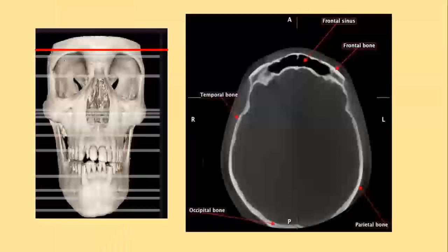Right. I thought I'll spend a few minutes here on gross anatomic landmarks. I mean, this lecture could go on and on, but I'll just briefly cover it. I think this is the biggest challenge for many of us mappers. So I would suggest get any anatomic landmarks book, get a picture, put it on your desktop. Your diagnostic center would also help you with all these. Many of them would mark landmarks if you want them to. They could use that help.